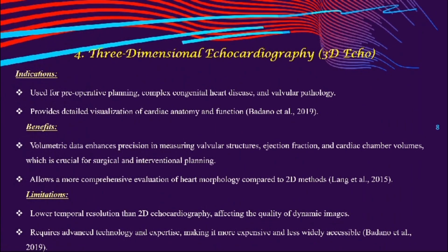3D echo, also known as three-dimensional echocardiography. Indications. Used for preoperative planning, complex congenital heart disease, and valvular pathology. Provides a detailed visualization of cardiac anatomy and function.